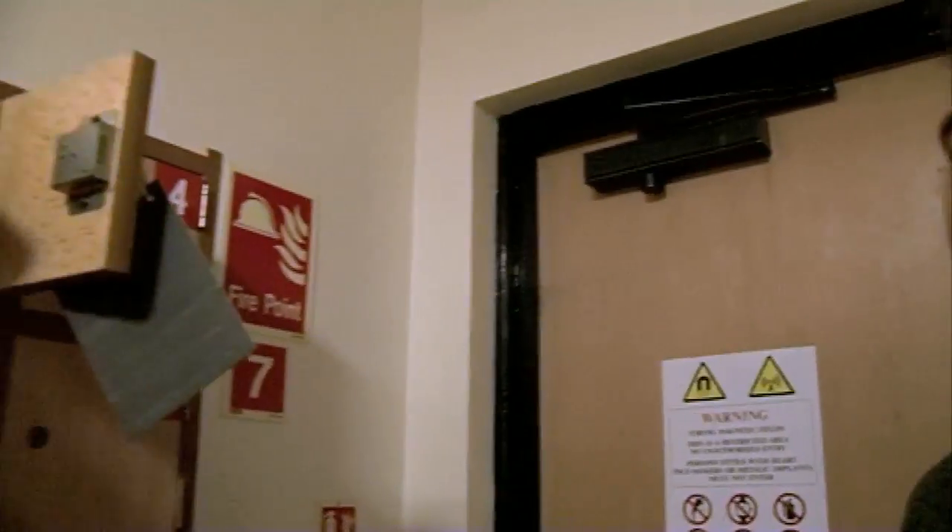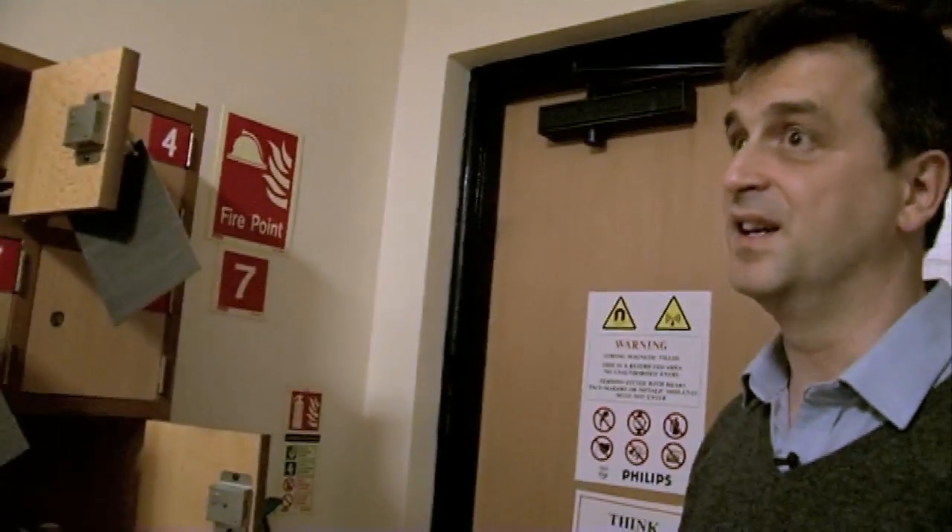We're going into an area where the magnetic field is very strong, so we have to take out anything that could be magnetic because there's a danger it will get pulled into the magnet.